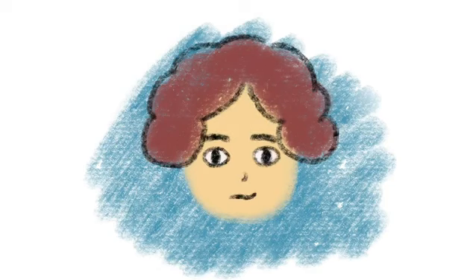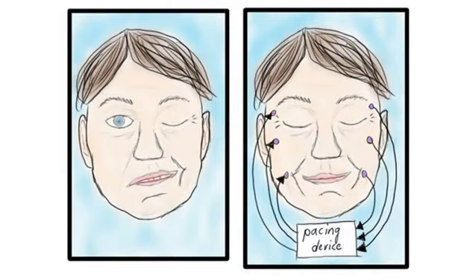Patients with unilateral facial paralysis experience impairment of facial activity on one side of the face. They cannot correctly control their facial muscles for daily activities, such as blinking. Our proposed device aims to detect a patient's blinking from the healthy side of the face and synchronously deliver an electrical muscle stimulation current to the paralytic eye to restore blinking functionality.